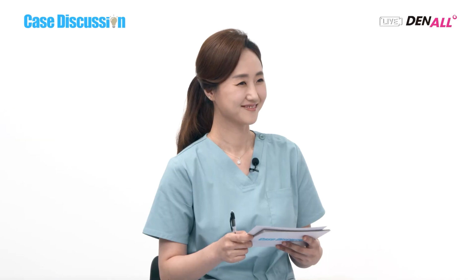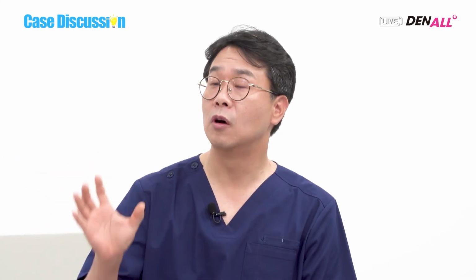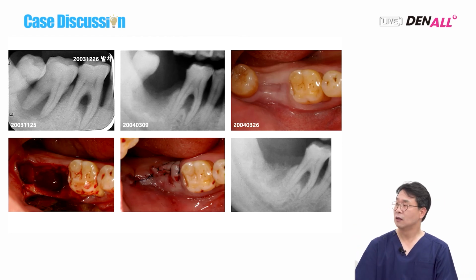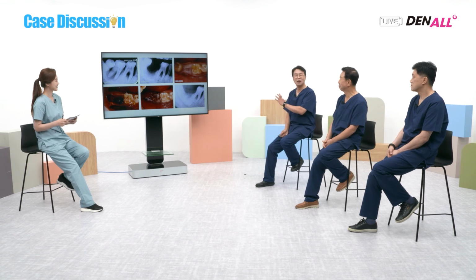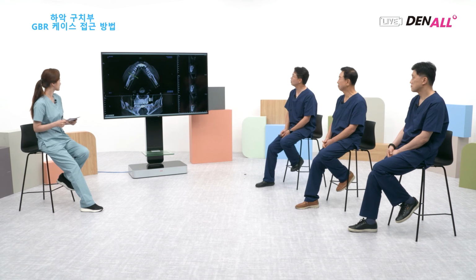So I followed that. You talked about autogenous bone and xenograft. I tried to use autogenous bone. On the basis of xenograft, autogenous bone is used together. From the wisdom tooth, autogenous bone was harvested, and GBR was done in a normal way. The patient left and came back later. Implants were planned, but after a long time, the patient came back in 2010.